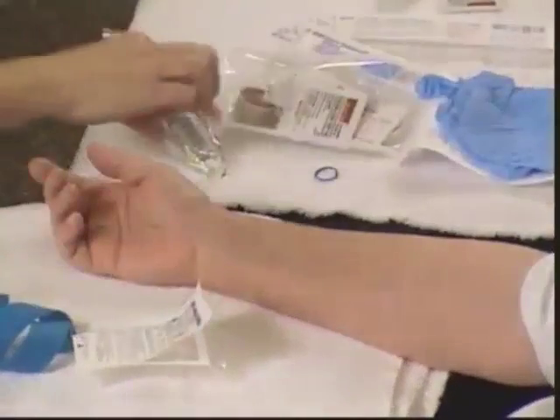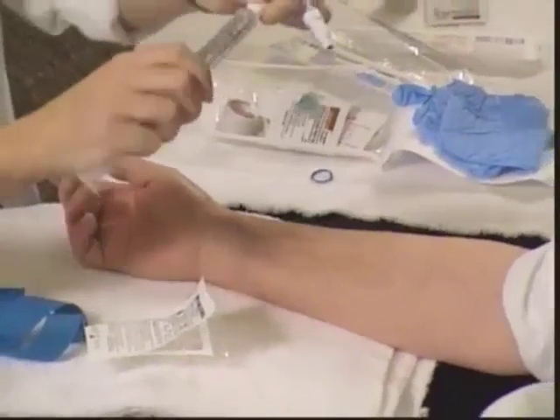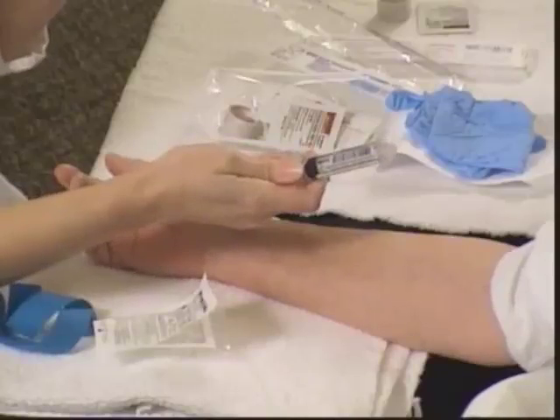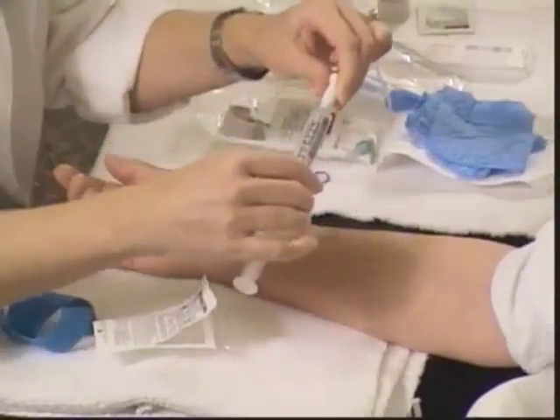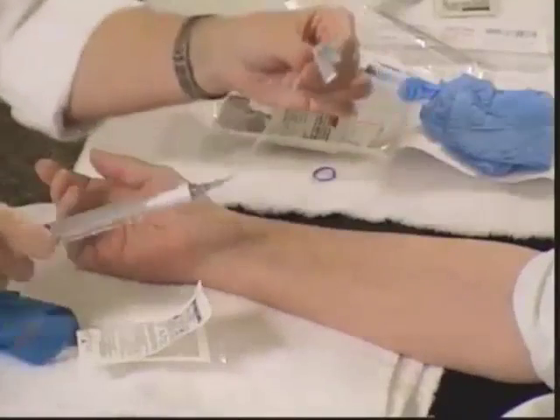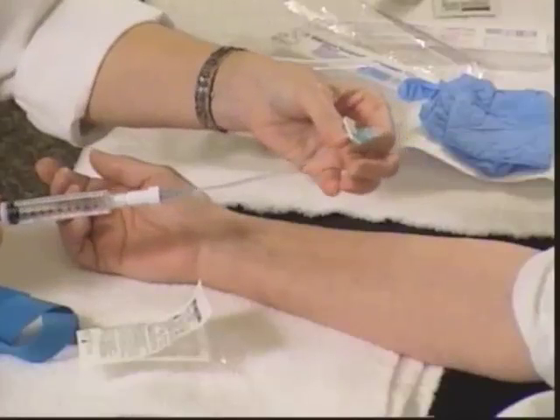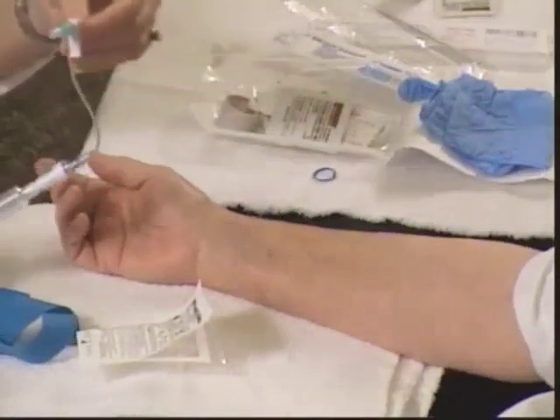We're going to get our saline out of the package. When these salines come pre-packaged like this, there is always a little bit of air in the end. You pull backwards on your plunger and hold it straight up and down to get every bit of air out until you see saline coming out the end. Then you can connect this straight onto the extension set — it just luer locks on. Remember, you don't ever want to send air into your patient; that's very dangerous and can even result in death. Always be sure everything is primed — watch the fluid come through until you see it drip out the end, and then you know all the air is out.